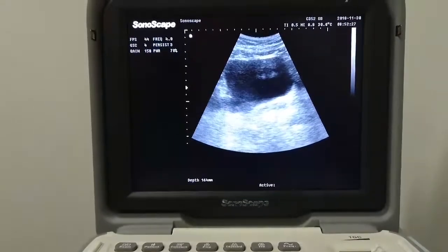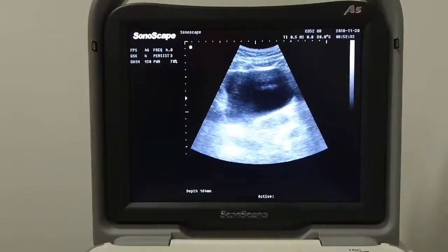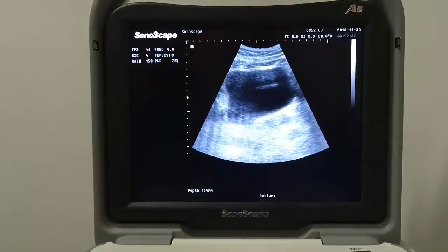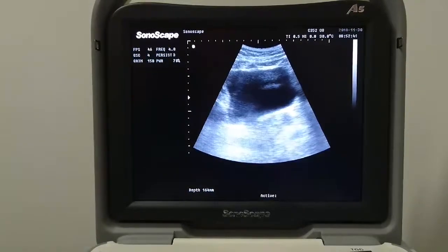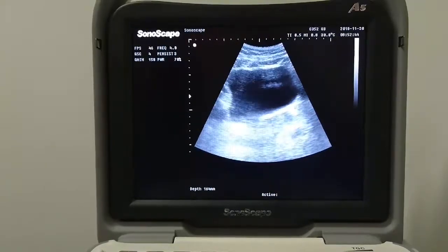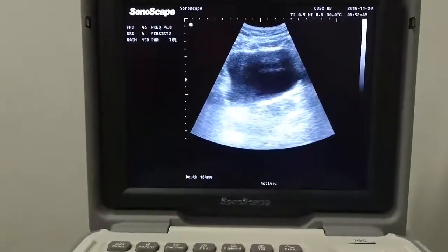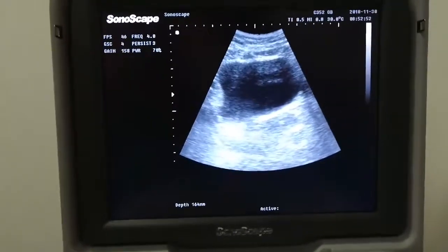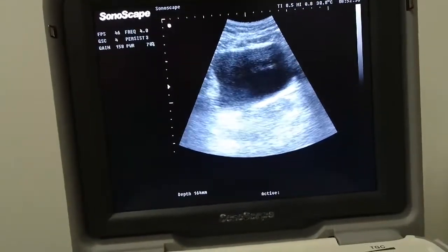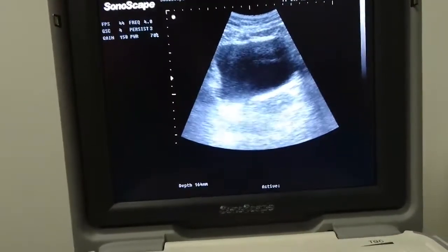This is the screen where you can see the bladder in the middle. The muscles sit down the bottom of that irregular circle. Can you focus on your pubic bone, please? Squeeze and hold the pelvic muscles. And then relax. What we saw then is that the line where the muscles are is dropping slightly. What we actually want is for those muscles to lift. So in this position, I wouldn't get this person to be doing their exercises.